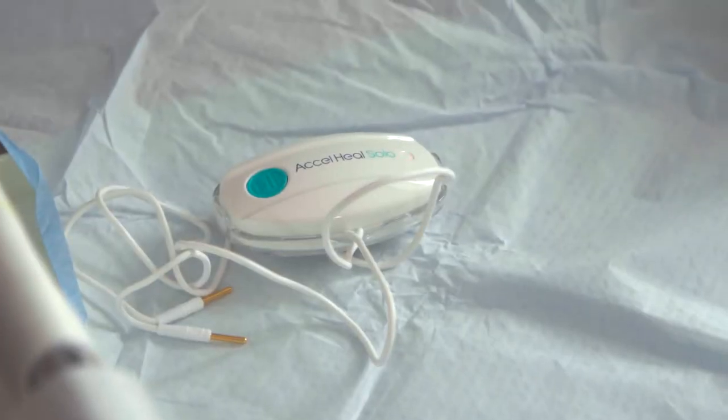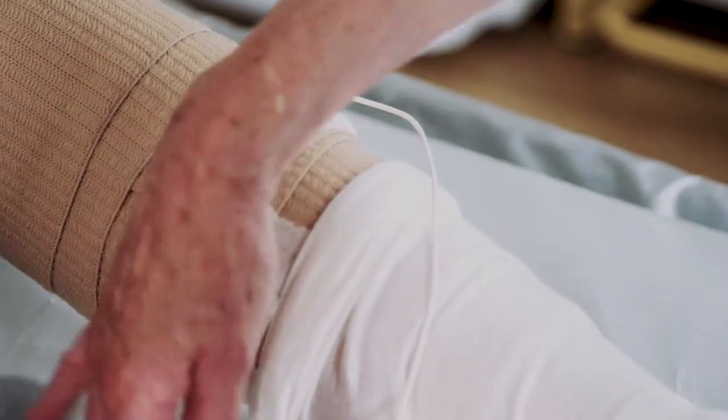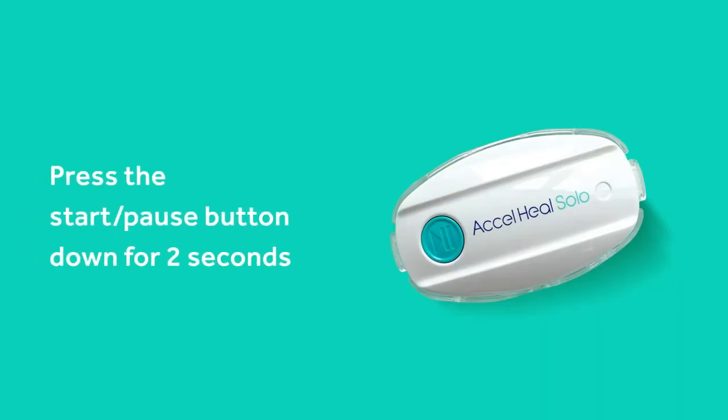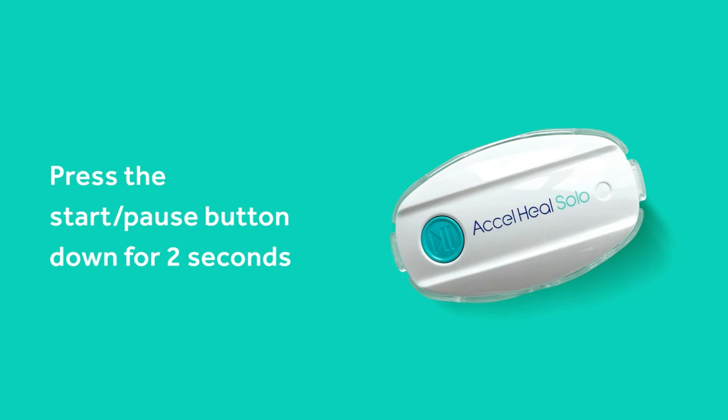Once you have applied the compression wrap, you are ready to connect the Axel Heal Solo device to the electrode pads. Connect the treatment device to the electrode pads by pushing the electrode connectors into the electrode pad receptors. Activate the treatment by pressing the start-pause button down for 2 seconds.